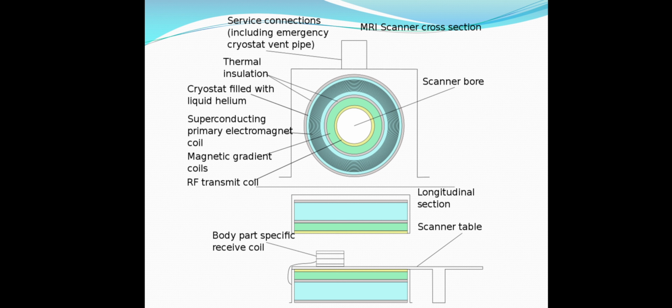As these coils are rapidly switched during the excitation and response to perform a moving line scan, they create the characteristic repetitive noise of an MRI scan as the windings move slightly due to magnetostriction. The contrast between different tissues is determined by the rate at which excited atoms return to the equilibrium state. Exogenous contrast agents may be given to the person to make the image clearer.